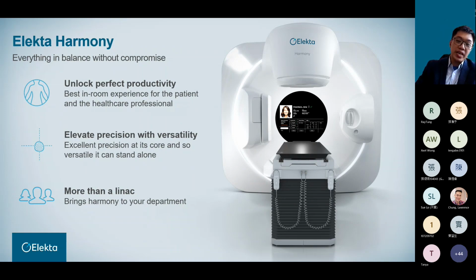So to build upon what Elekta Infinity has, the next layer of Linacs is Elekta Harmony. Basically, Elekta Harmony is a new Linac that we have released to the market. This allows you to have a perfect balance between productivity as well as precision. So what Elekta Harmony has is precision at its core, and its versatility is top-notch.